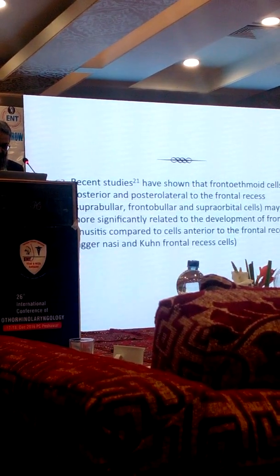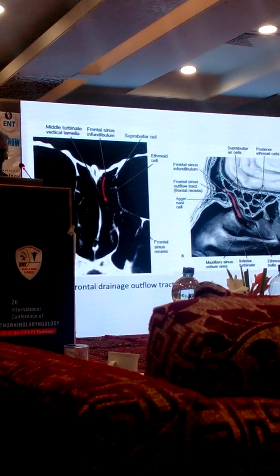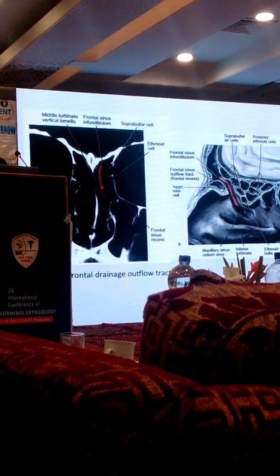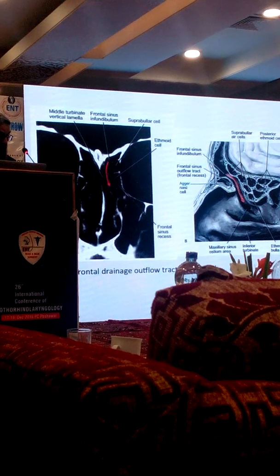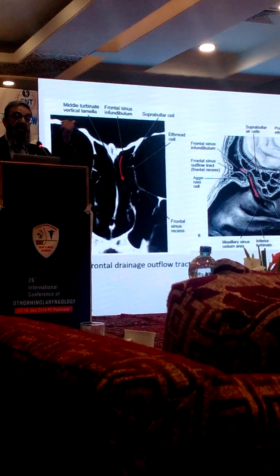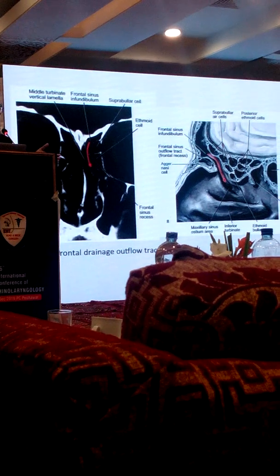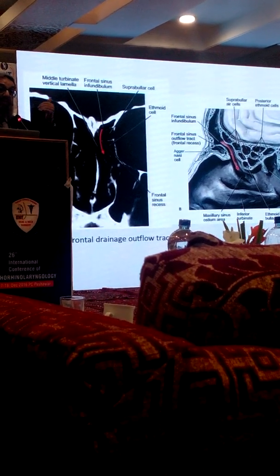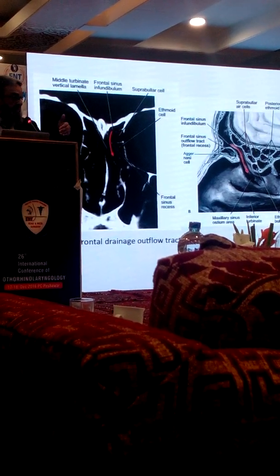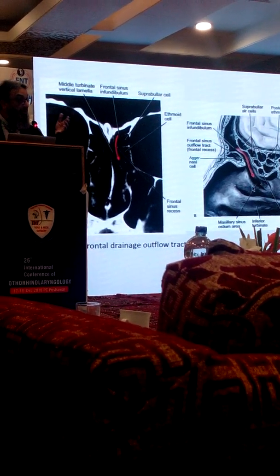Okay. Just wanted to show you this, and this will be my last slide. Sorry, I'm just showing frontal and agger nasi and frontoethmoidal cells. So this area will be narrow. So if we find these cells, we have to remove, uncap, decap, whatever it is, this area. It has now been reported in the literature that most of the frontal sinus recurrence or residual disease after endoscopic sinus surgery is because of these cells, frontobullar cells and frontoethmoidal cells.